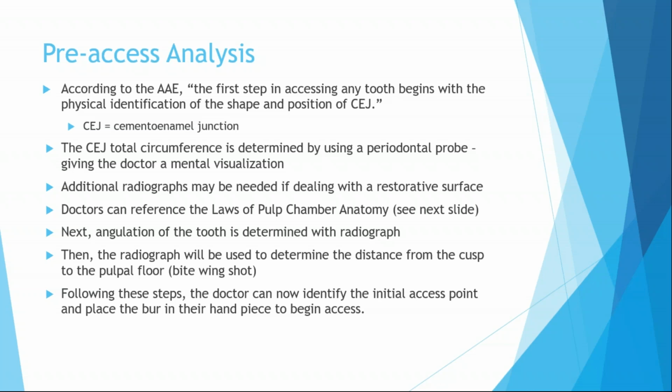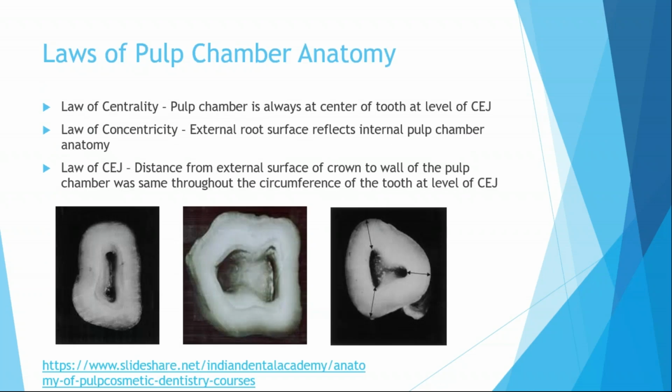handpiece to begin access. So the laws that I was talking about, there's 9 of them, but these 3 are really the ones that doctors reference a lot in all of the different PowerPoints and things that I was reading. This continually kept being referenced. So that first picture there, law of centrality. So basically, pulp chamber is always at the center of the tooth.